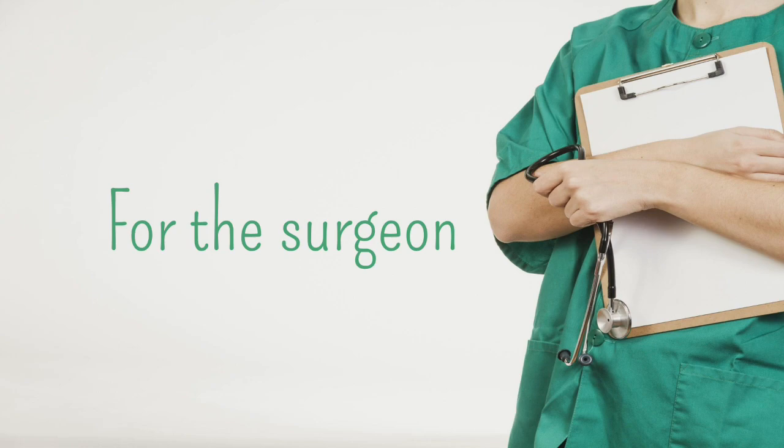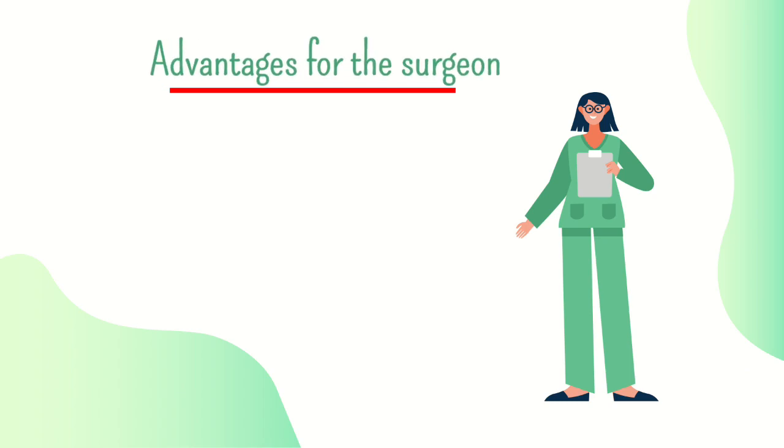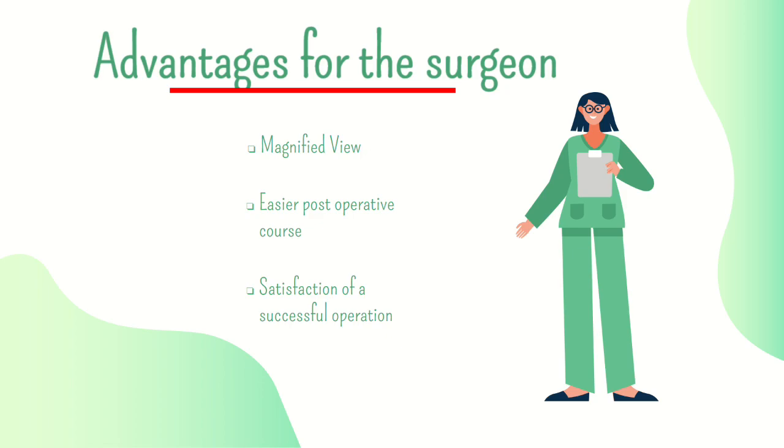Now, let us move on with the advantages and disadvantages laparoscopy has for the surgeons. An advantage of laparoscopy for the surgeons is that they have a magnified view. Surgeons can easily visualize the vessels surrounding the organs that they want to manipulate. MIS has an easier post-operative course, and of course, the unparalleled satisfaction after a successful operation.